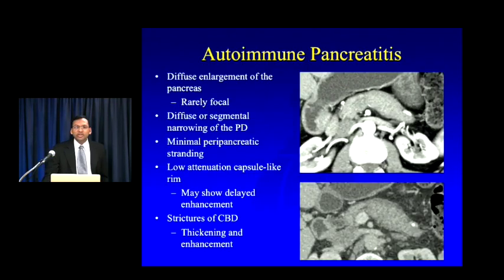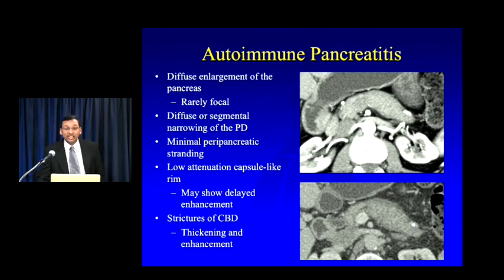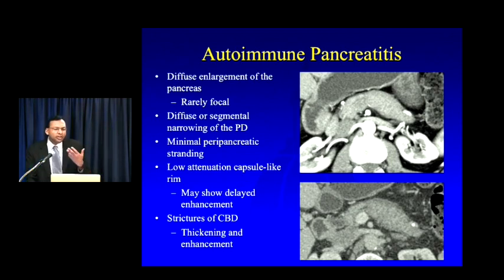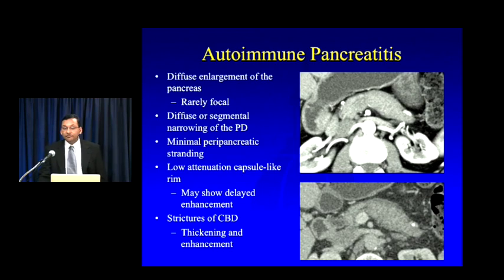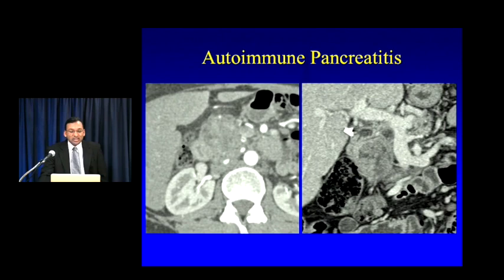Another increasingly recognized diagnosis is autoimmune pancreatitis. Usually it diffusely involves the pancreas — diffusely enlarged pancreas, a low-attenuation halo, possible delayed enhancement of that halo, and often associated autoimmune IgG4-related cholangitis with strictures of the CBD and thickening/enhancement of the distal CBD at the level of the ampulla. The problem is that autoimmune pancreatitis can rarely be focal — especially involving the head — and can look very much like pancreatic cancer. Here's an example: a mass in the pancreatic head not obstructing the pancreatic or common bile duct, which should raise suspicion it's not adenocarcinoma, but focal autoimmune pancreatitis can be virtually impossible to exclude underlying malignancy.